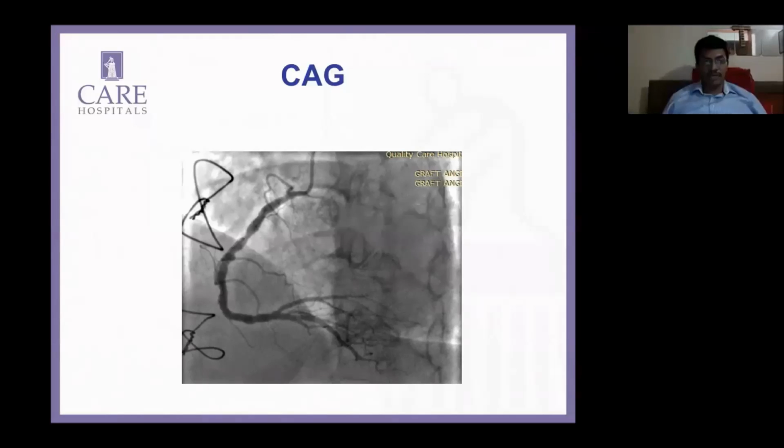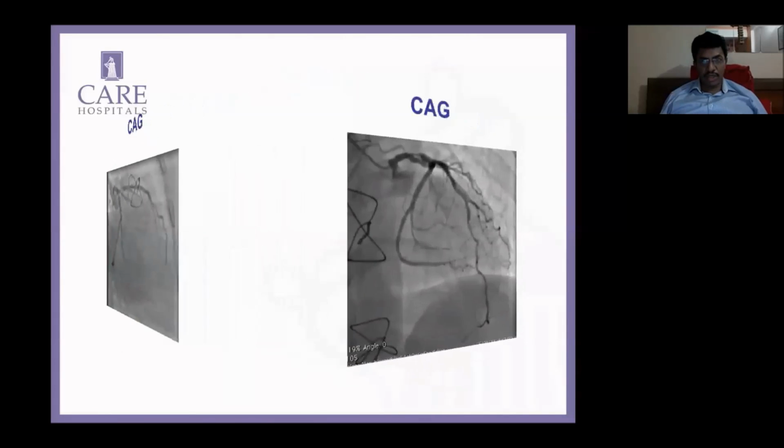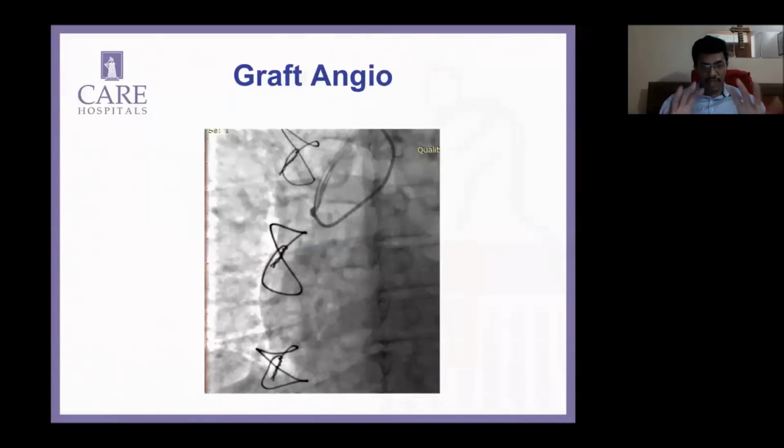I've had a look at the videos myself and I agree with you. There's no competitive flow in any of the videos. We had a doubt about the ostium, but just based on this picture, we thought it was just borderline, if at all. So that was our take on that. So we did the CT. I would also agree with you at this point of time.